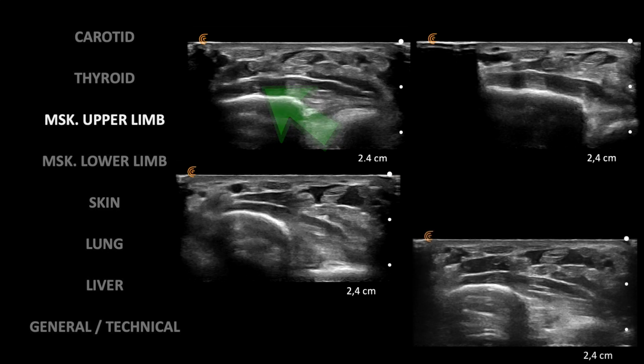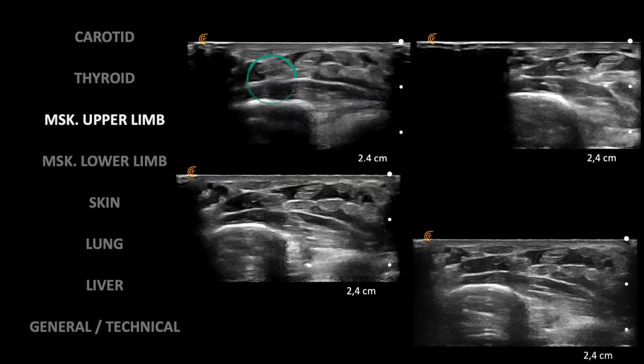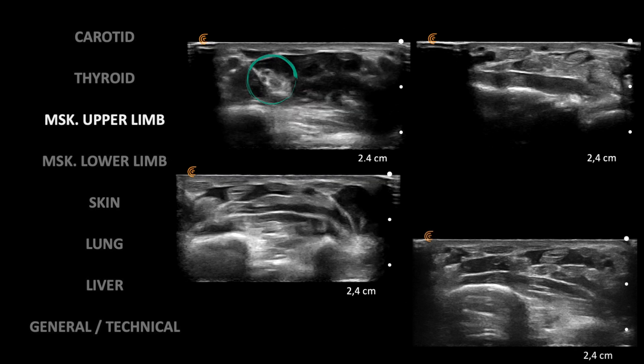And this is a palmar wrist view at the flexor sheath or carpal tunnel level. Appreciate the difference between tendons, muscles, and the median nerve — shown inside the blue circle.